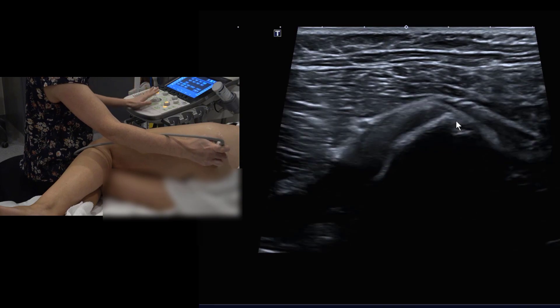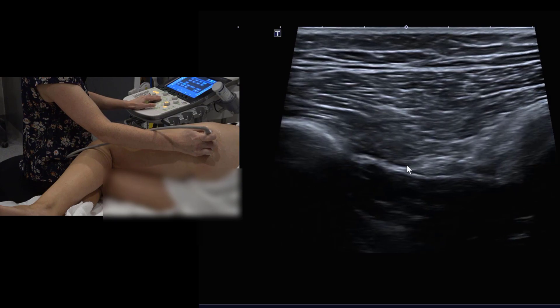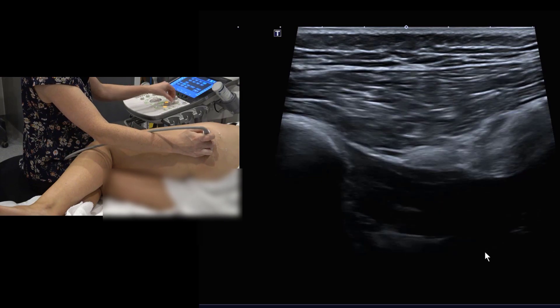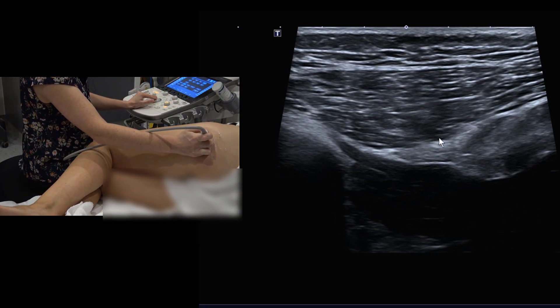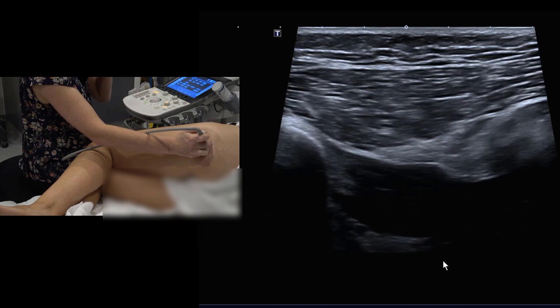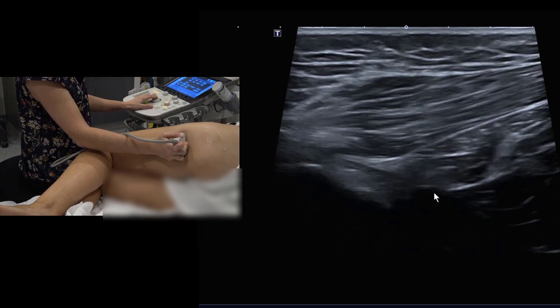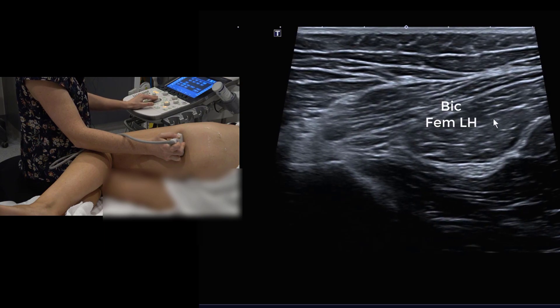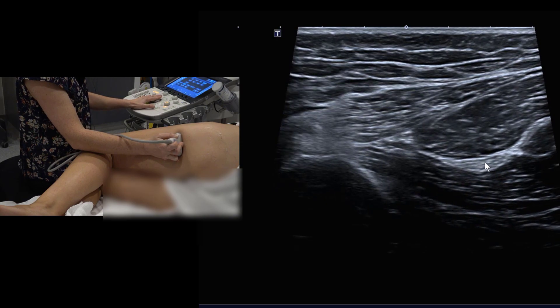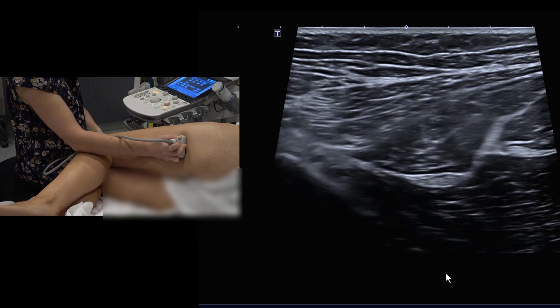For sciatic nerve excursion, move from the hamstring origin laterally to identify the sciatic nerve overlying the quadratus femoris. We'll demonstrate this in longitudinal first — move below the level of the quadratus femoris, identify the sciatic nerve deep to biceps femoris and in front of adductor magnus, then perform hip flexion, knee extension, and dorsiflexion.